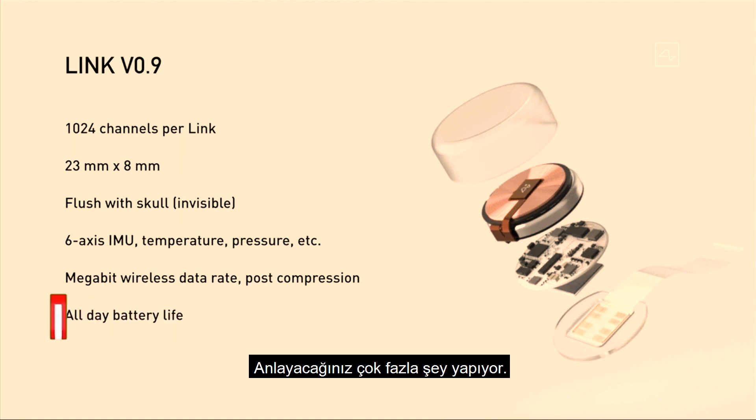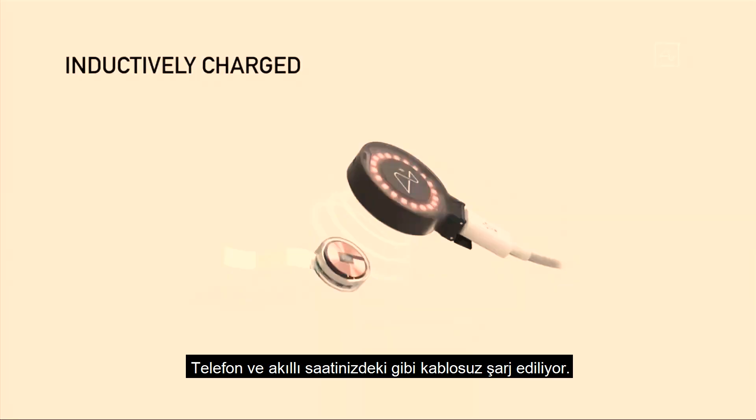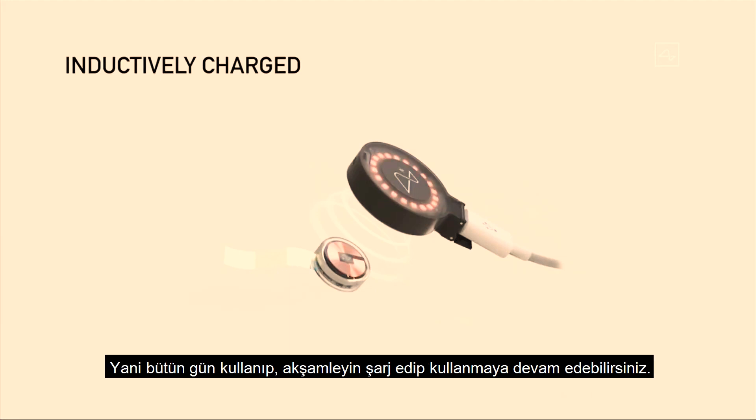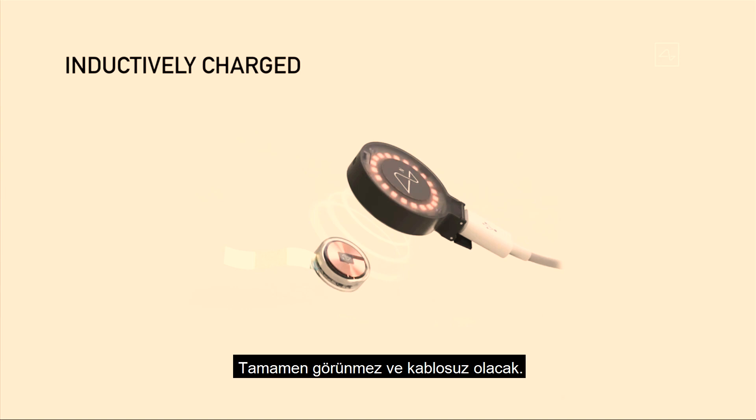It does a lot — it's sort of like if your phone went in your brain or something. Maybe that's not a great analogy. It's also inductively charged, the same way you charge a smartwatch or a phone. You can use it all day, charge it at night, and have full functionality. It would be completely seamless — no wires.